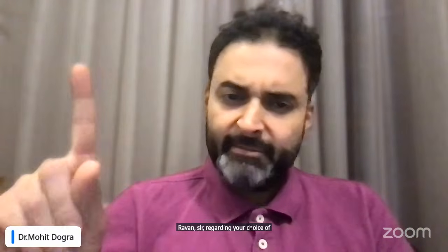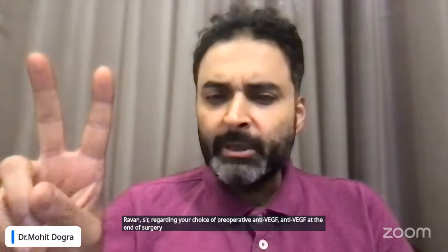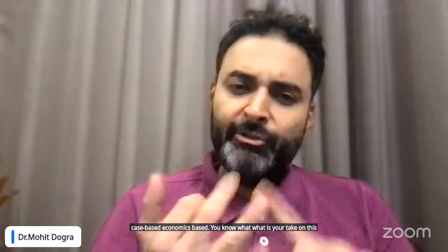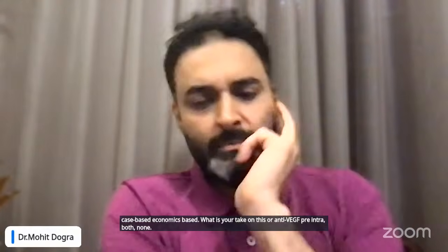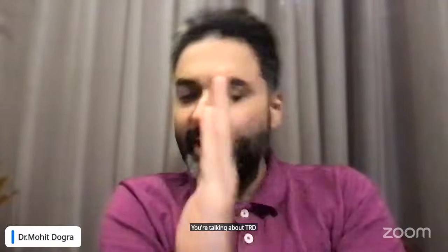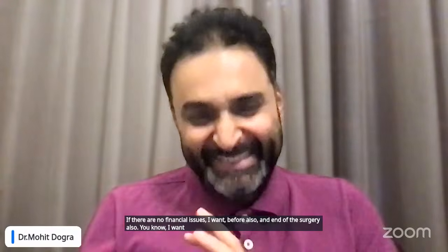Raman sir, regarding your choice of pre-operative anti-VEGF or at the end of surgery, both case-based and economics-based, what is your take on this, sir? Anti-VEGF pre, intra, both, none? Okay. You're talking about TRDs. TRDs and CRDs, sir. Tractional and combined detachment, sir. If there are no financial issues, I want it before and also at the end of the surgery.